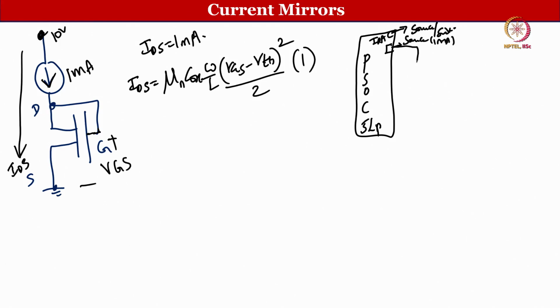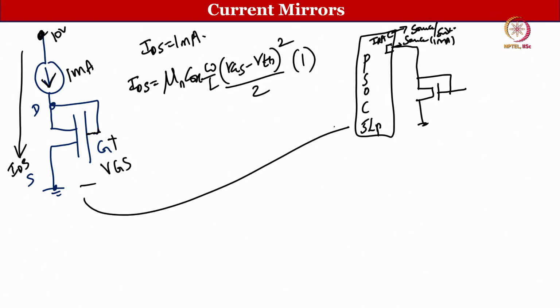Now, I will connect this to an NMOS transistor, same story, you can visualize, right. And there is a provision in the PSOC 5 microcontroller that I can make it a source or a sink or stop it completely, right.